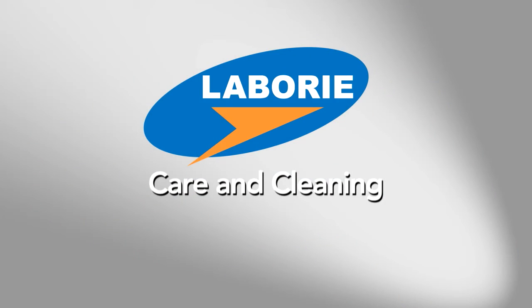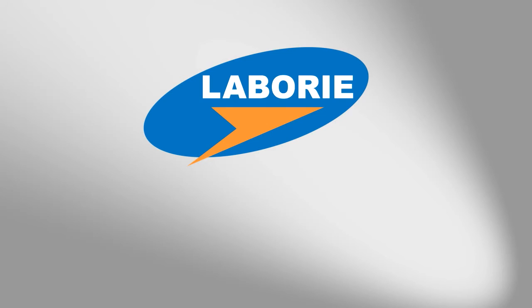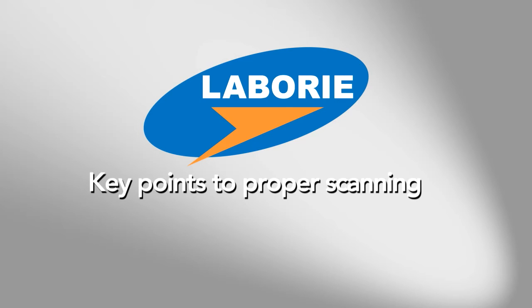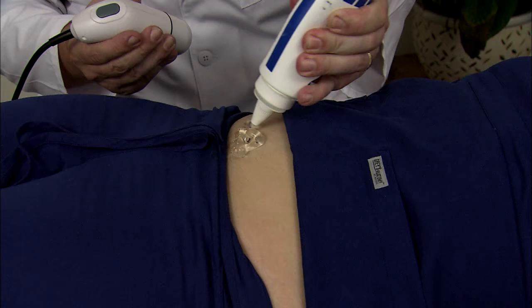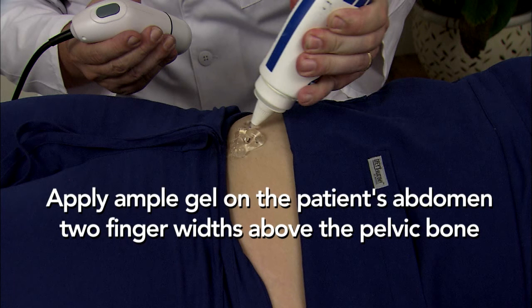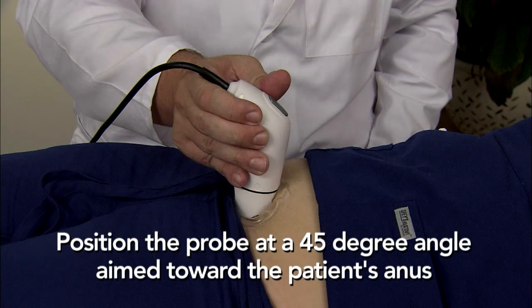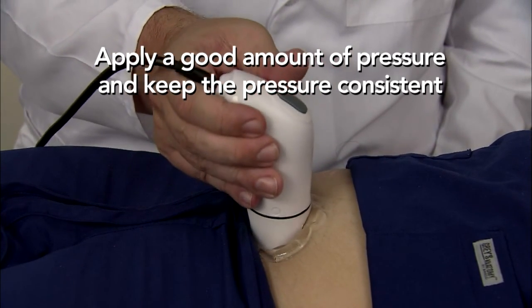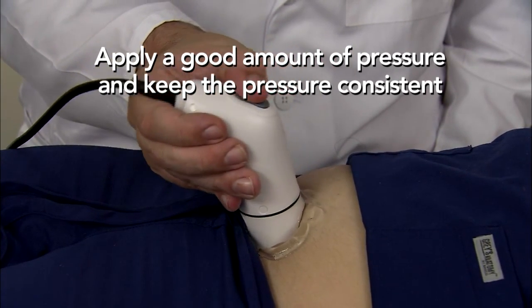The system can be cleaned using a regular SaniWipe or any kind of soft solution. Do not soak the machine. Here are some key points to ensure proper scanning: apply an ample amount of gel on the patient's abdomen two fingers above the pelvic bone; position the probe at a 45-degree angle aimed toward the patient's anus; apply good pressure and keep pressure consistent until the scanning phase is complete.